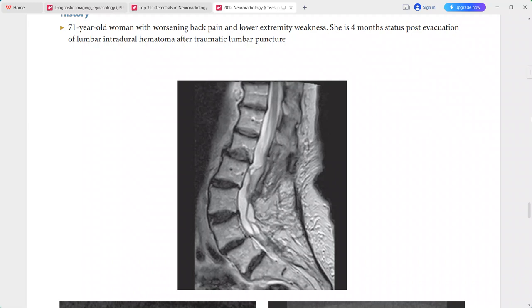A 71-year-old woman presenting with worsening back pain and lower extremity weakness. She is four months status post evacuation of a lumbar intradural hematoma after traumatic lumbar puncture.